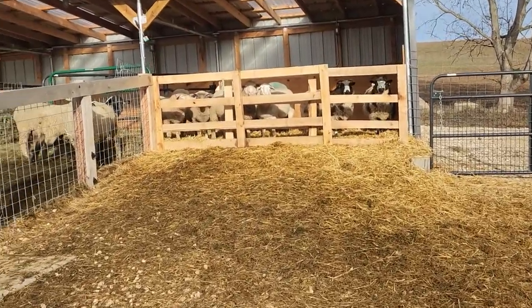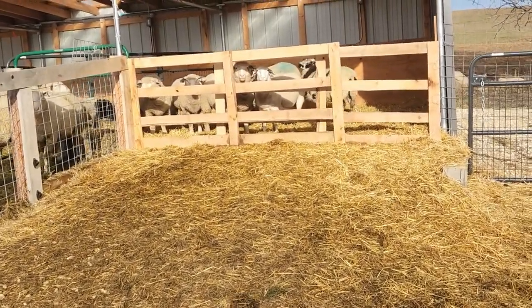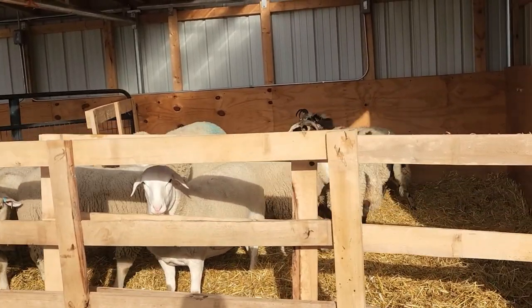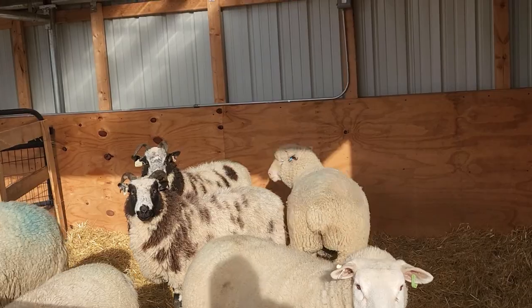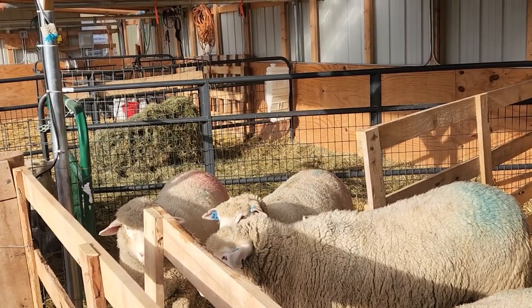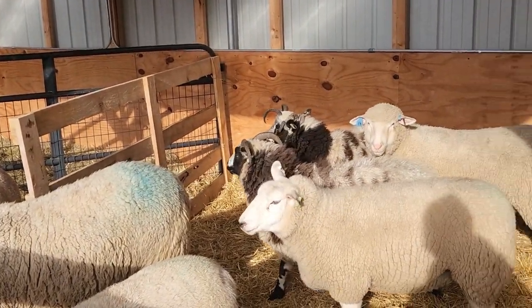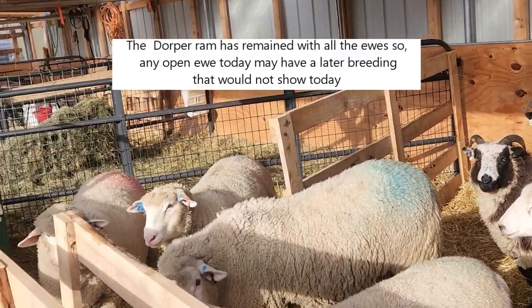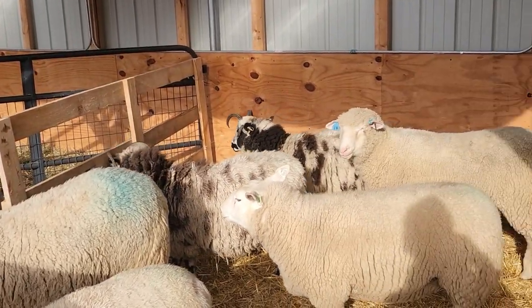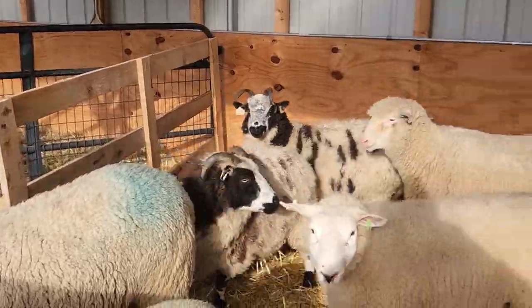Most farms, when they scan, when they mark them, they put 1 dot on the ewe with a single. Twins receive no dot because the majority of sheep have twins, hopefully, and then triplets receive a different dot or different color. Since I have 2 separate scanning groups, I'm going to put the same color dot, just 1 dot for single, 2 dots for twins, and then 3 dots for triplets or more. Hopefully no triplets, but that way anything not pregnant today will get scanned again. So when it comes time to sort them in February, anything that doesn't have a marking on it will get scanned again. So that's the plan, and we'll let these ladies back over into the other paddock.